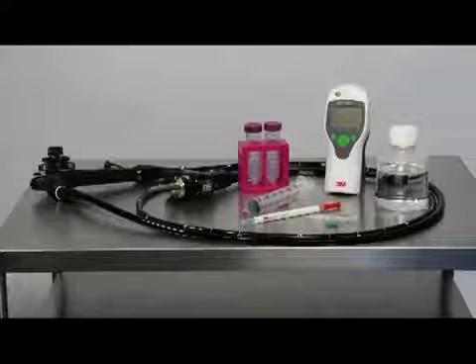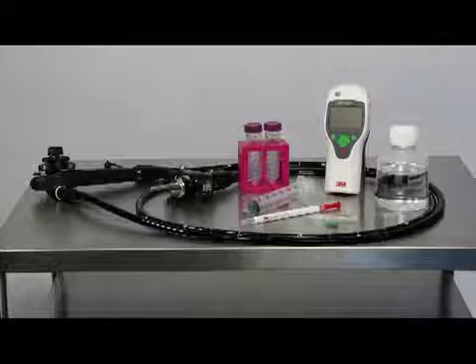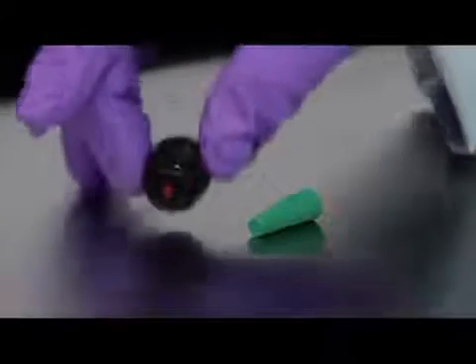What we're going to do now is look at the alternate procedure. Some people do not like to actuate that valve and hold it down. They'd rather have that plugged up. So you remove that valve, and that's again the suction biopsy valve, and you're going to be putting in a plug or a stopper. So you want to put it in firmly.